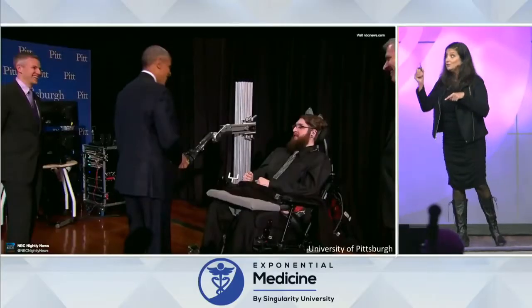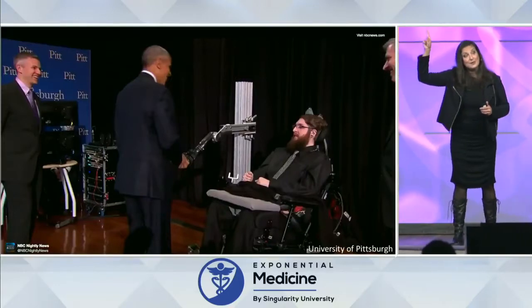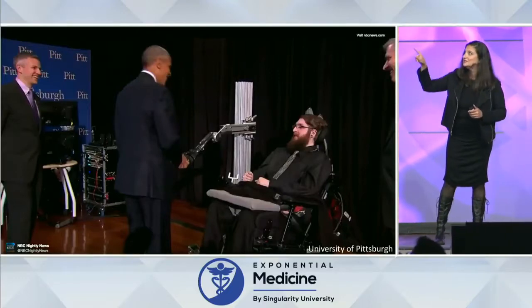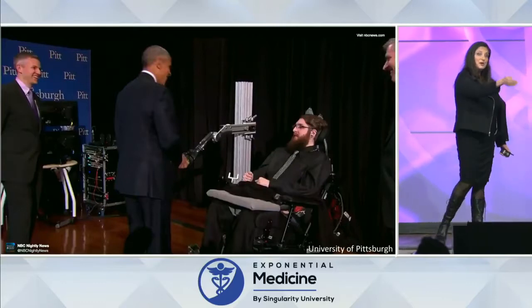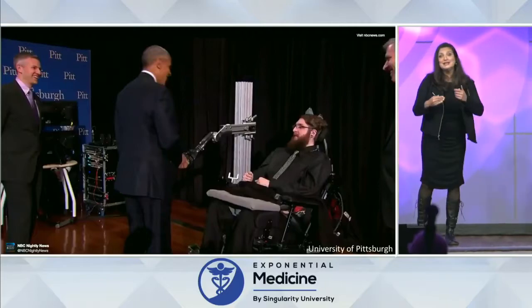Similarly, last night, I believe you saw a clip from the University of Pittsburgh where this work is being done. There's an array implanted in this man's head, but it's not in his motor cortex, it's in his somatosensory cortex. And what that allows him to do is that robotic arm, which President Obama is shaking, he can feel the sensation of Obama shaking his robotic arm as if that arm is attached to himself, because those brain signals are actually going into his sensory cortex. Now, the key here, again, is how can we actually make this kind of thing less invasive?